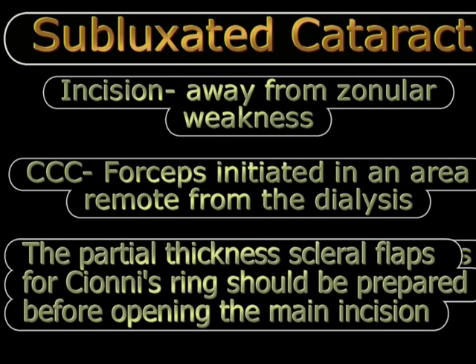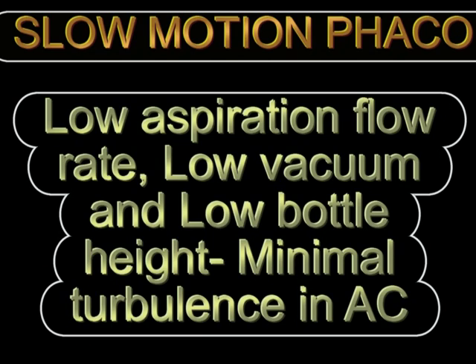Some key tips to remember: the incision is placed away from the area of zonular weakness; the capsulorrhexis is initiated with forceps in an area away from the dialysis, bearing in mind that counter-traction will be reduced. If using a Cionni ring, partial-thickness scleral flaps for suturing the ring should be made before opening the main wound so the globe does not become hypotonic. Slow-motion phaco should always be performed with low aspiration flow rate, low vacuum, and low bottle height to minimize turbulence in the anterior chamber and stress on the zonules and capsular bag.